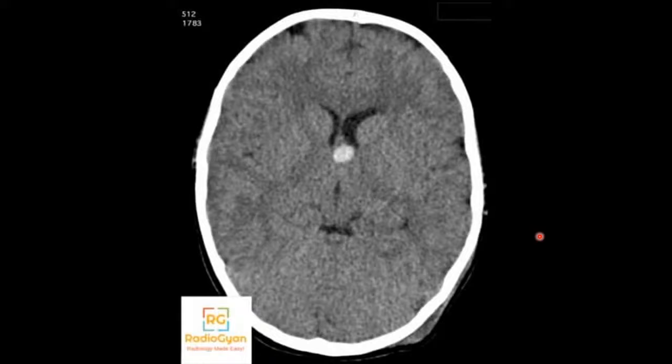Okay, so most of you have got it right. So this is a colloid cyst of the third ventricle. Most commonly, these are located at the foramen of Monroe. The typical imaging appearance is that of a hyperdense cyst, which is unilocular and which is located at the foramen of Monroe. In 50% of the cases, these can be T1 hyperintense as well.